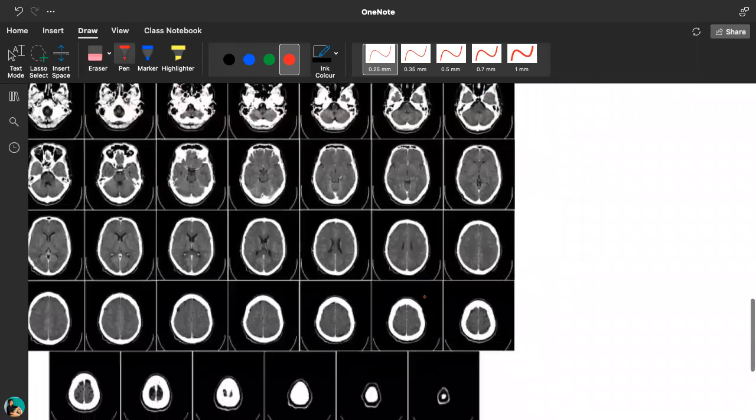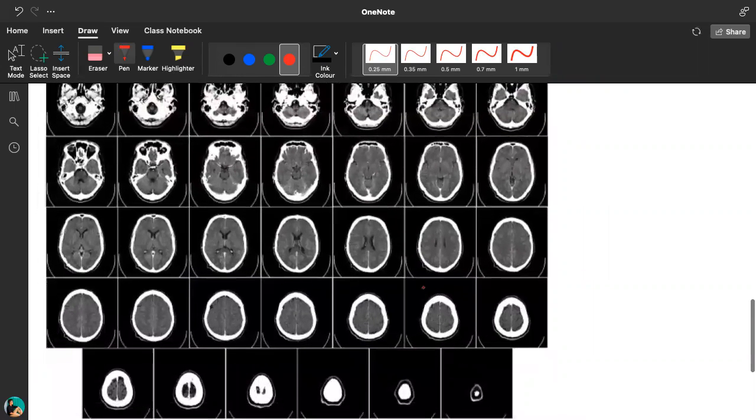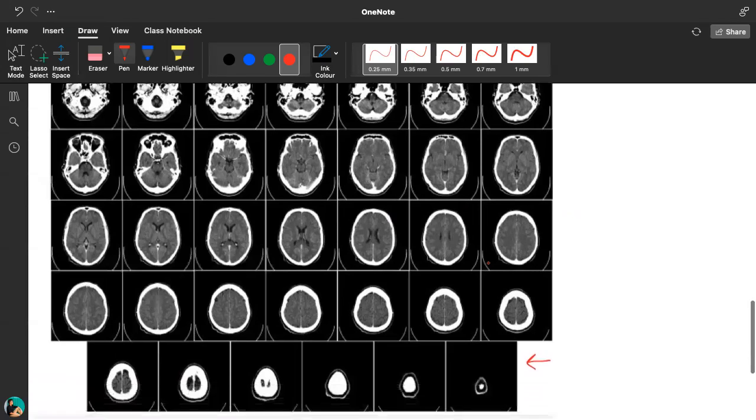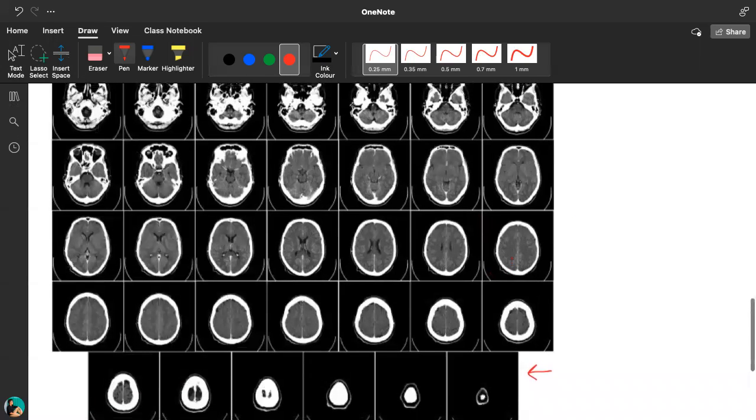This is the picture of the brain, of the human head. From the bottom picture, the first one, this is starting from the top. You scan the top slice and then go to the next one, the next one, the next one. You're going down from the top to here, to the chin. So every single image is like you go from one slice to the other. It's a cross-sectional view. They combine every single slice of the image, and then they form a 3D image of the human head.